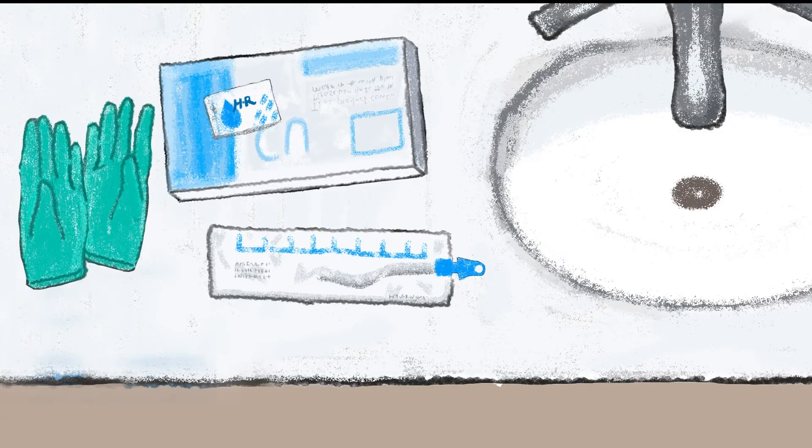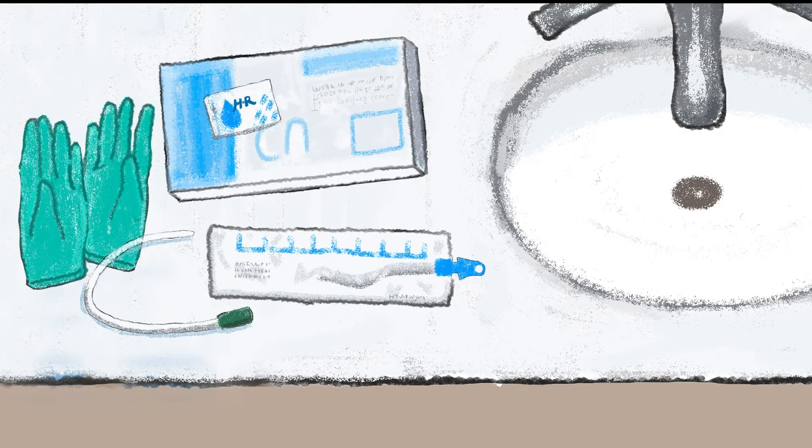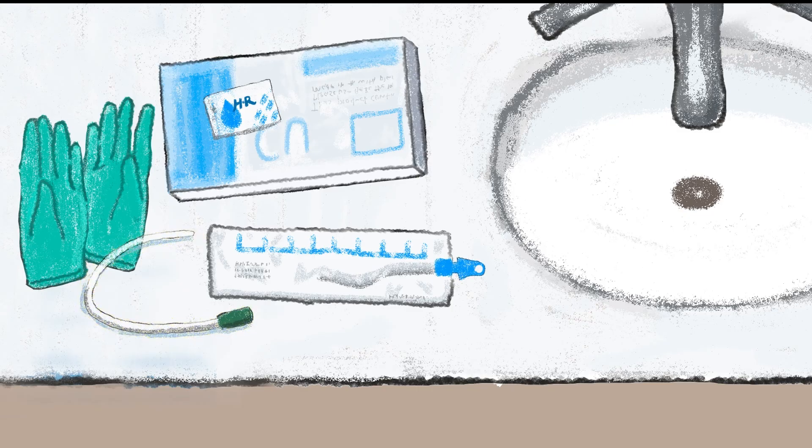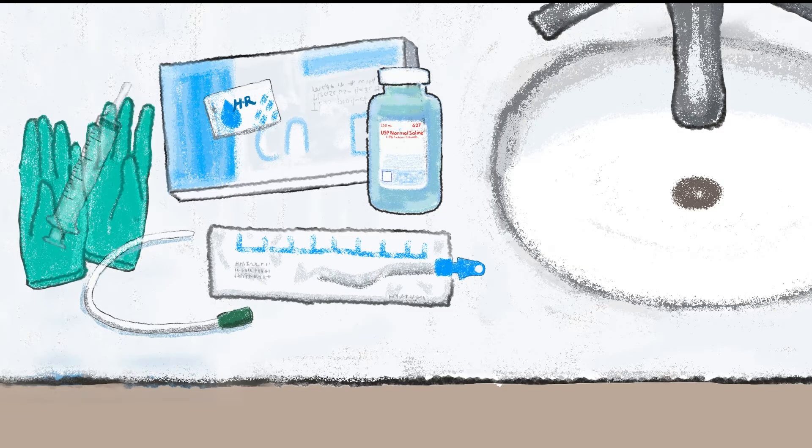First I collect all my supplies, which usually includes a catheter kit or a new unopened catheter, lubricant jelly, and a collection container. If it's time to flush my bladder, I'll have saline solution and a big plastic syringe too.